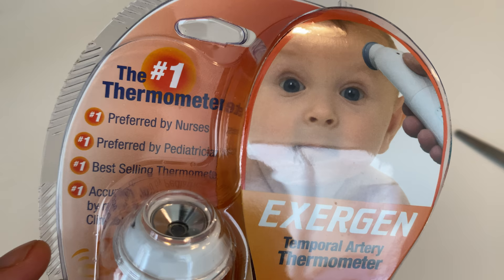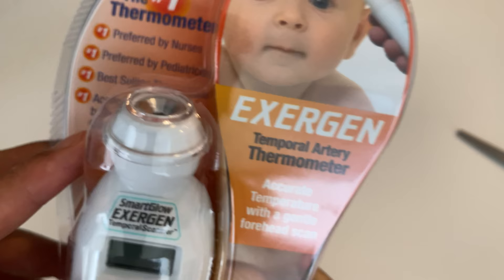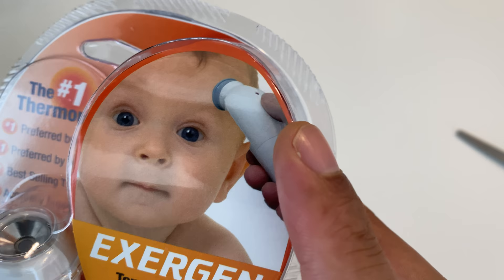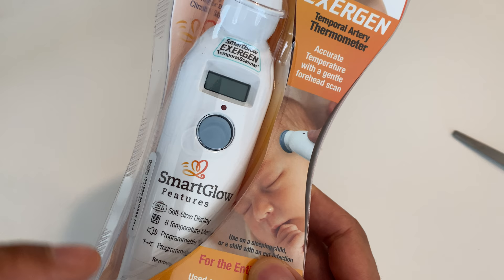It says it's the number one thermometer preferred by nurses in pediatrics, and the best-selling thermometer. It says accurate, supported by more than 50 clinical studies. The front of the box shows a picture of a baby with the thermometer against the child's head — that's how you take the temperature. Stay tuned, I'm going to compare this to other thermometers that are out there.